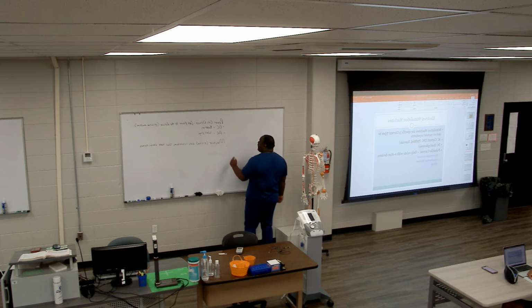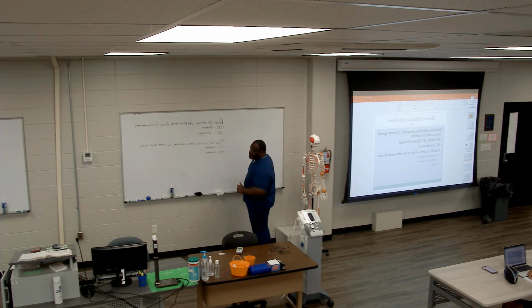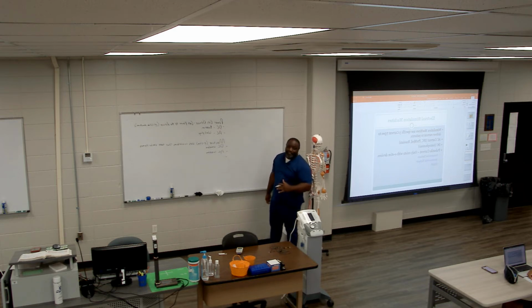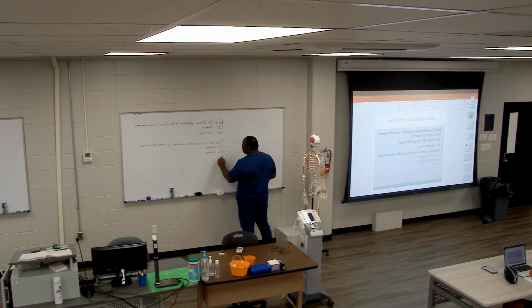So most E-Stim devices will say they have a direct current waveform, and they have an alternating current waveform. And then they'll have another one that only exists in the use of electrical stimulation devices. You'll only find this third current type when you're dealing with E-Stim. It doesn't exist anywhere else in nature. And that's going to be pulsed waveforms.